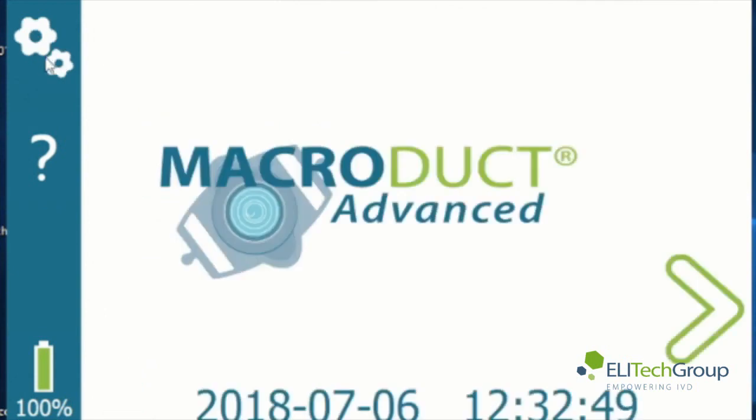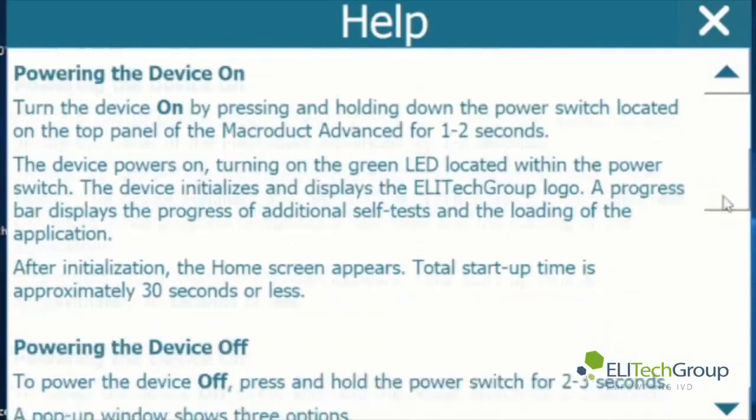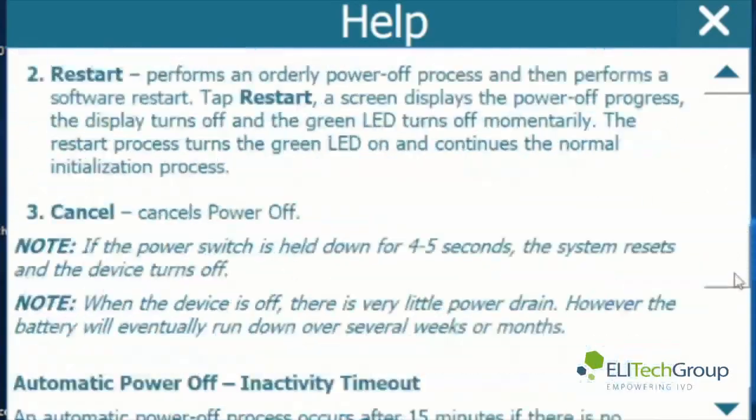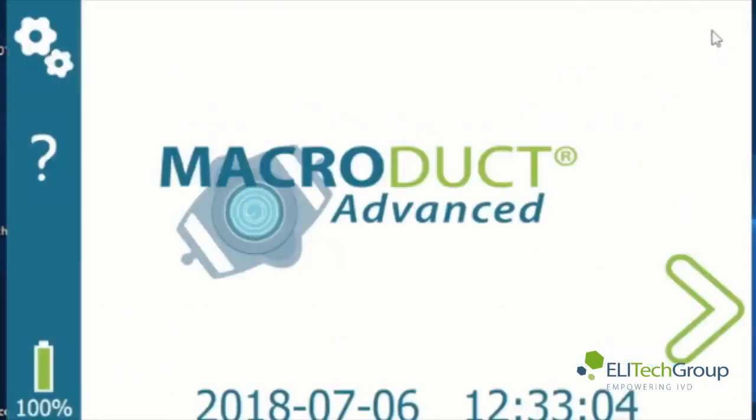Press the home button, then press the question mark button — this is the help screen. You can press that question mark at any screen that you are in and it will give you the help information needed for that page that you're on. There's also a battery charge level indicator showing you the level of battery charge.